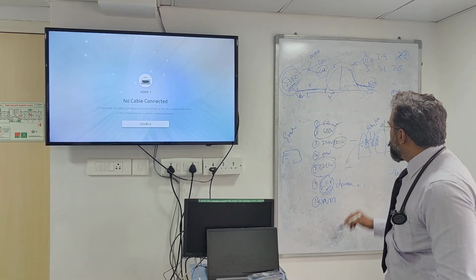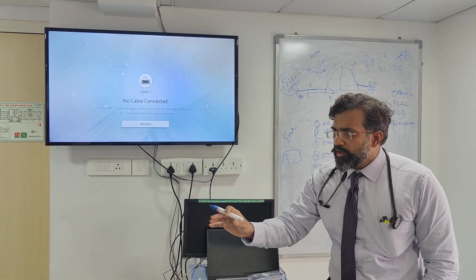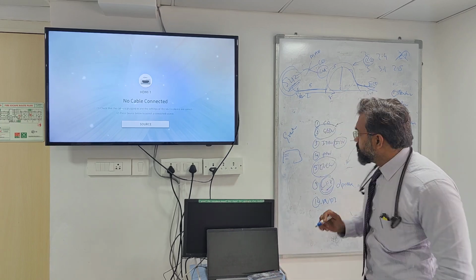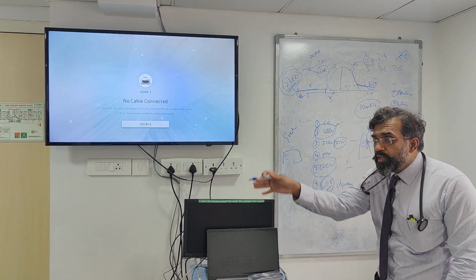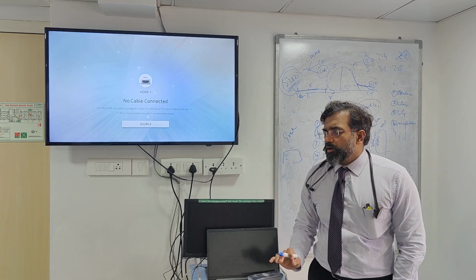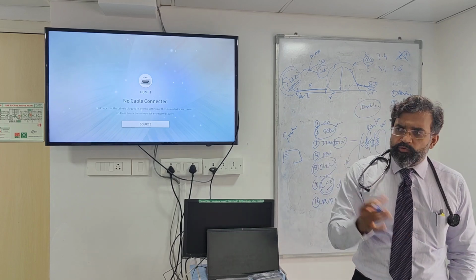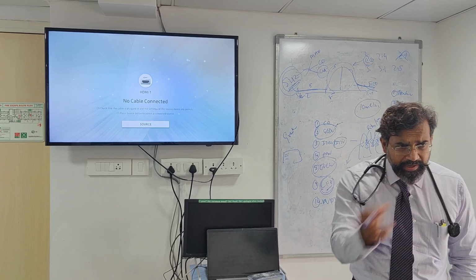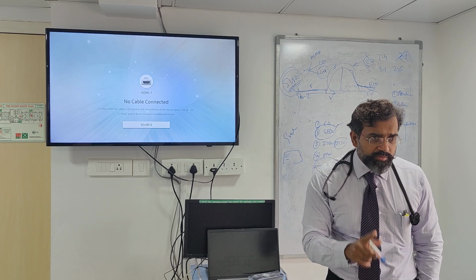The PVPI tells you that in the event that your extravascular lung water is high, more than 10. When you say high, it's more than 10. Not 7, that is okay, but more than 10. If your extravascular lung water is more than 10 ml per kilogram, it is known to be pulmonary edema. More than 7, 8, 9, it is not pulmonary edema. The volume content is 7, but it can go slightly higher. It has got some capacity to hold it. But once it goes more than 10 ml per kilogram, it now becomes pulmonary edema, right?